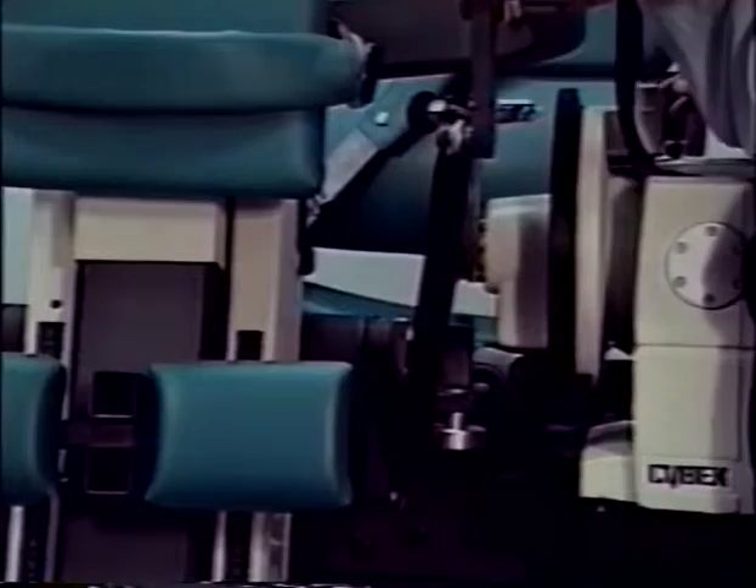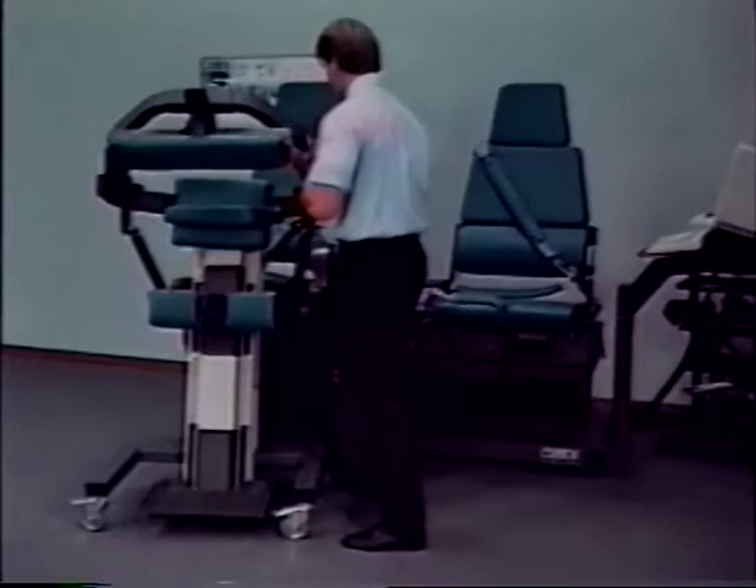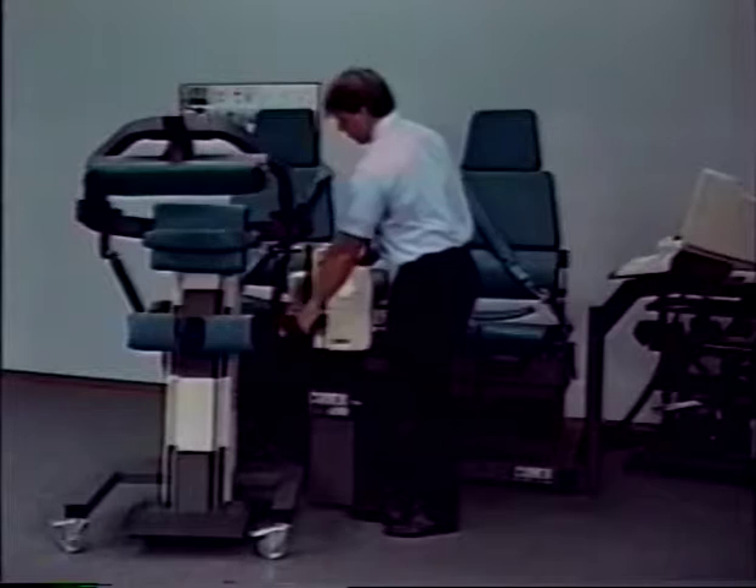The TEF modular component docking adapter and the Cybex 6000 dynamometer input arm will require fore-aft alignment. Do not push down on the dynamometer during this adjustment. Slide the TEF modular component fore-aft until the input adapter will slide into the dynamometer input tube when pushing down on the dynamometer.